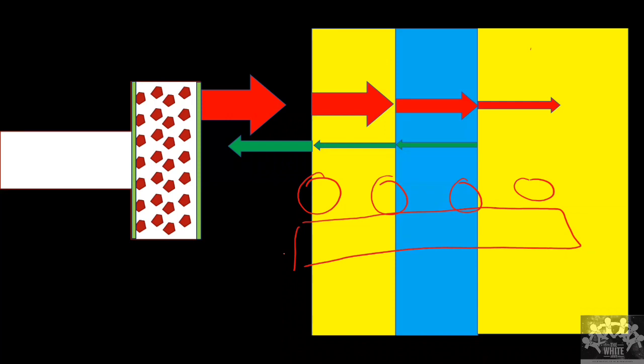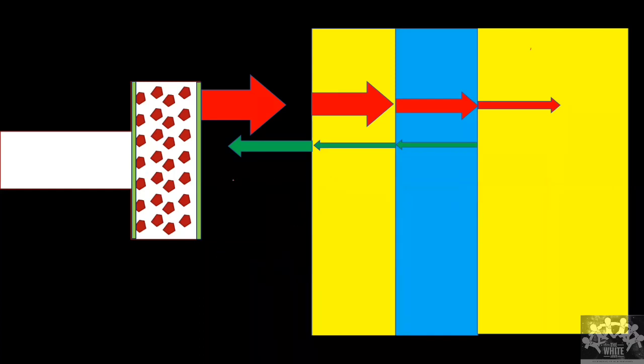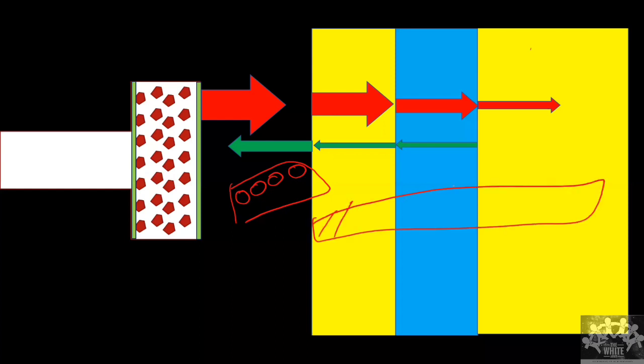So I know as I go deeper in a soft tissue, there is some reduction in the sound as I go deeper and deeper. So I keep adding some energy to the information I have got, so that all this reflected sound will appear almost similar if it is reflected from the same tissue. I make the probe such a way that it will reflect back the sound, and all the sound is of same intensity. Now that is one thing we need to keep in mind.